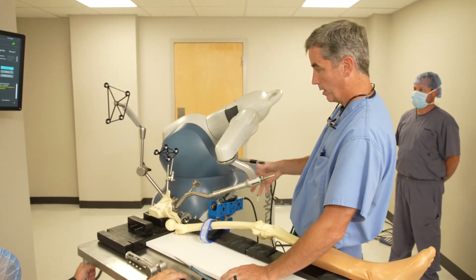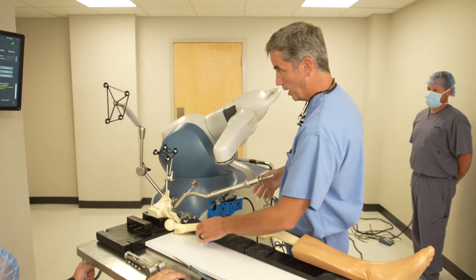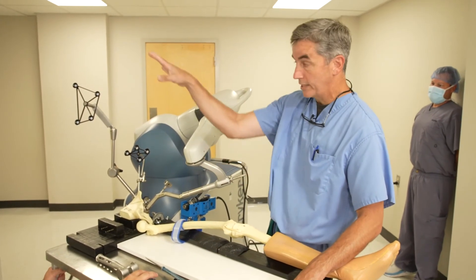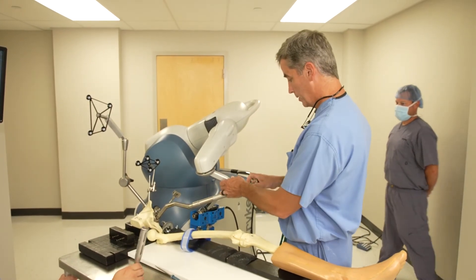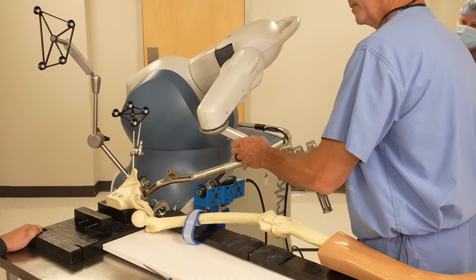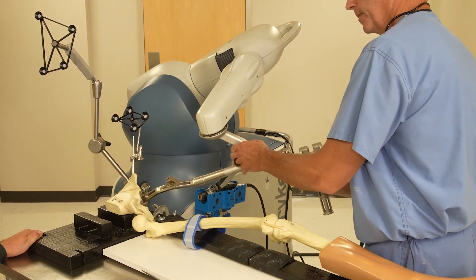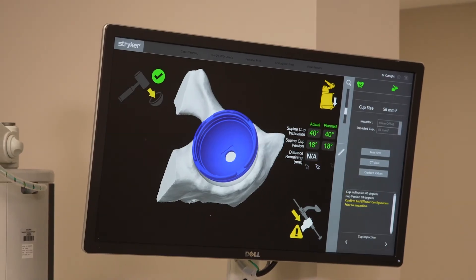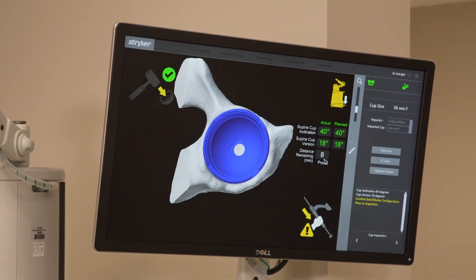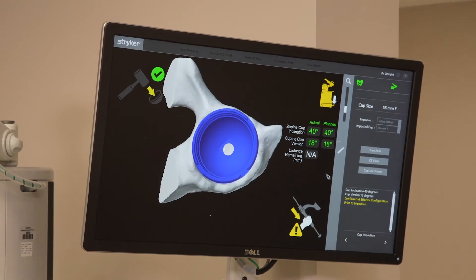You can see it's orienting — there it goes. Now it is going to hold that position while I pound the cup in in the correct orientation that we planned at the start of the surgery. This goes in to pound with. It tells us — so when we're in there, it shows us we're 12 millimeters proud, so we've got about a centimeter to put this cup down to be seated. In an ideal world, that number goes all the way down to zero. We're not going to hit this pelvis hard enough to put this cup in all the way, but that tells us when we're seated.